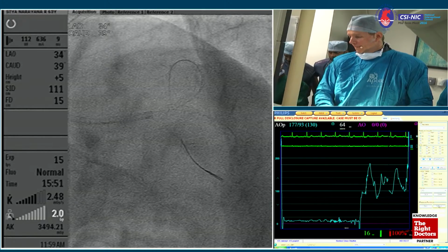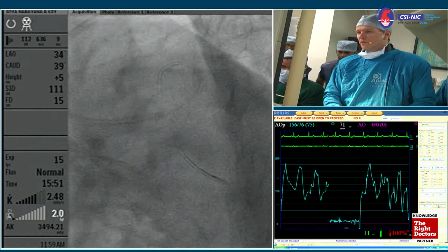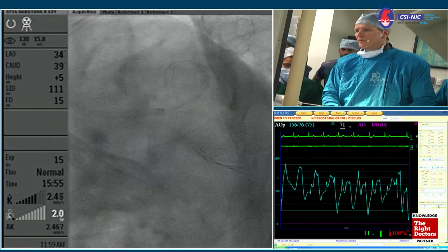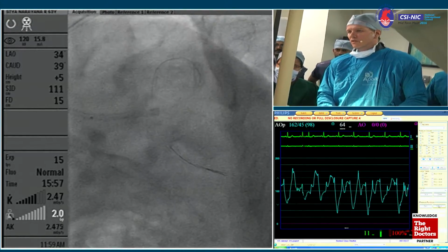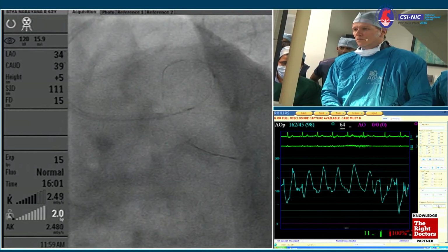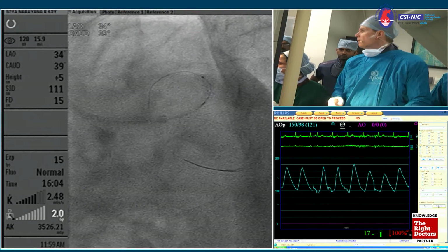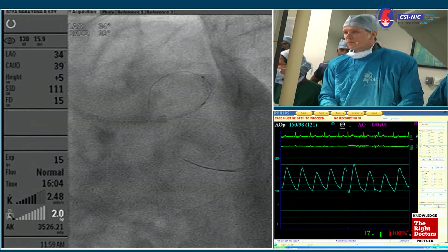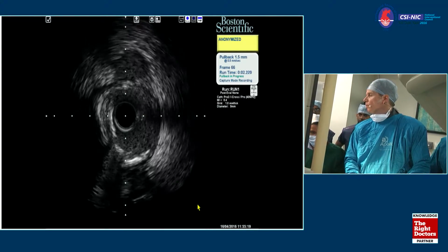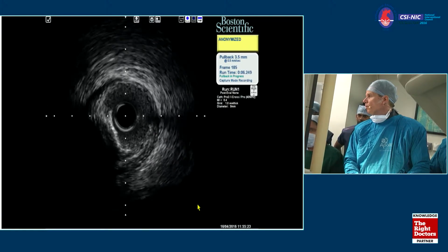Can we go in? Don't worry. So we could easily end up with a tub, no, which is for me absolutely fine, which is good. Are we okay? Okay. Go ahead. Absolutely. I would. So it's a good demonstration of the case. We are going to be disconnected in a minute.